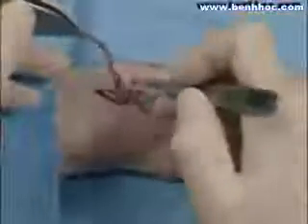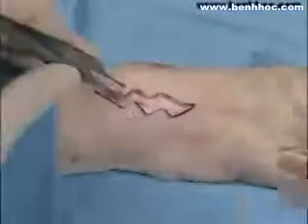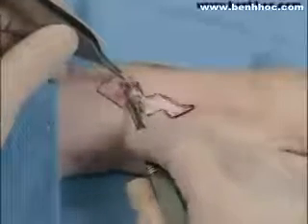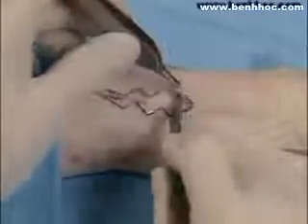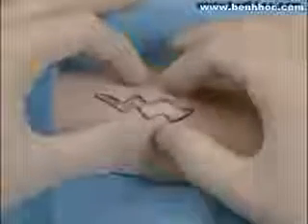Undermining continues, actually to remove the scar. And again, W-plasty is used to camouflage a scar not parallel to relaxed skin tension lines. Now the scar has been removed. You can see the area of the scar, and now the tissues are well undermined. Again, either a 15 blade or a dissection scissors may be used with the tips pointed upward so that you don't interfere with the underlying vasculature and then have to obtain hemostasis.